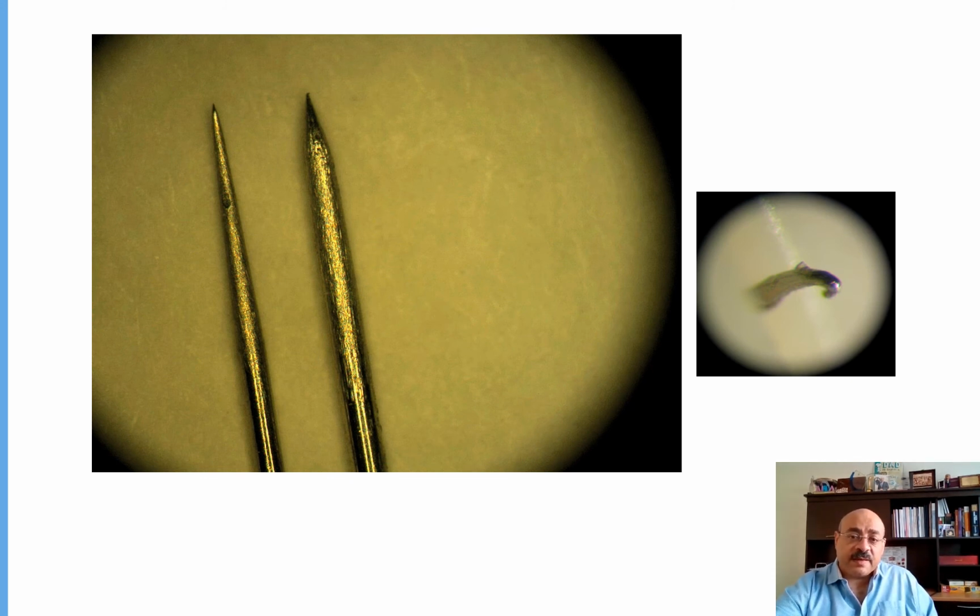Another important factor is the quality of the needle, the diameter of the needle and the quality. So when we have a thick needle like what we have in the photo here, this is going to be much more painful, and it is going to be associated with a bit longer downtime. When we have the right needle diameter, then the penetration is going to be much easier, much less painful, and it is not going to be associated with long downtime.